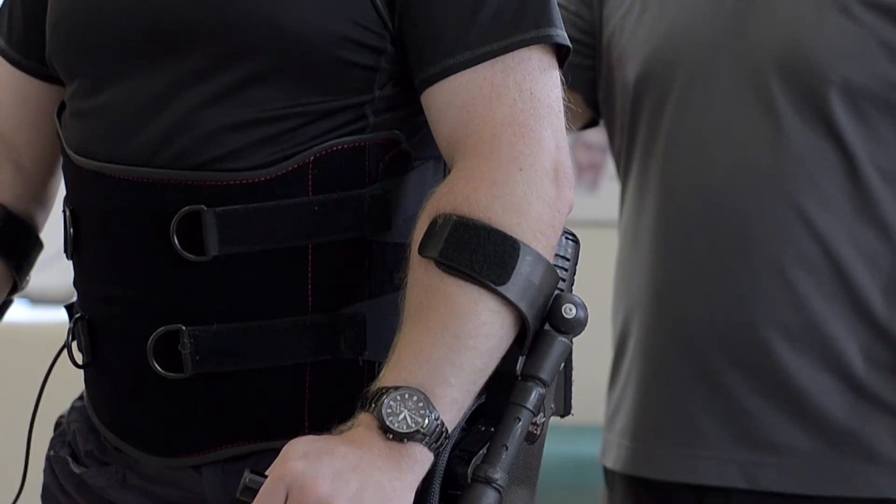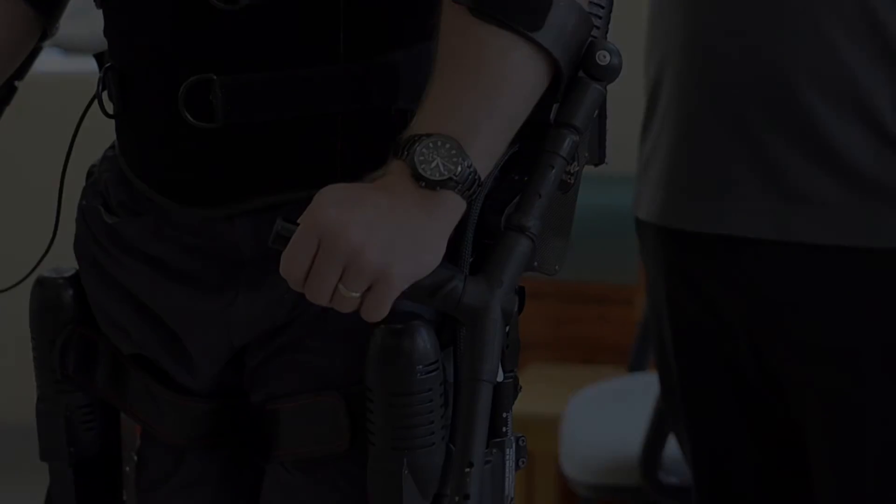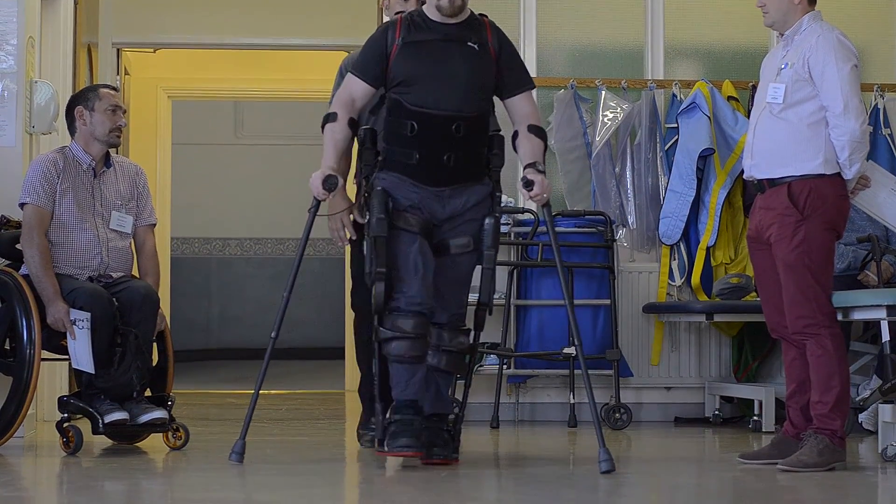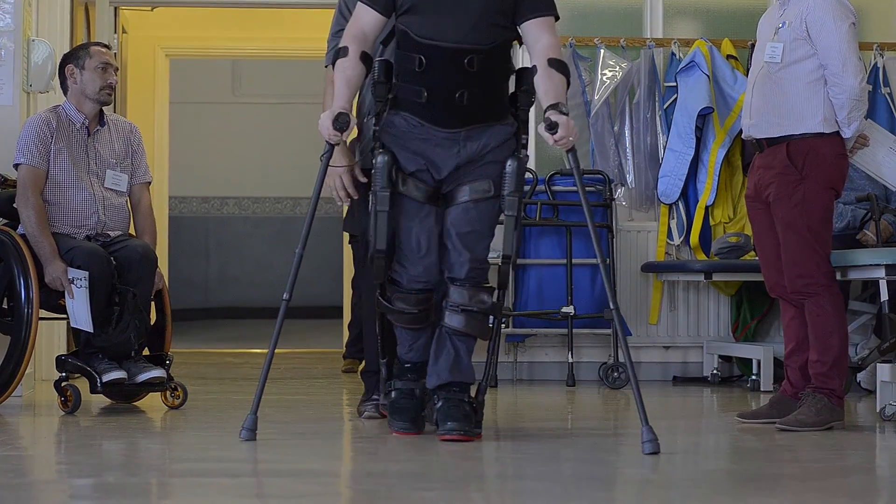Just a couple of button pushes on the interface will change the way that the machine works. Once we get to the left, we get to the right.